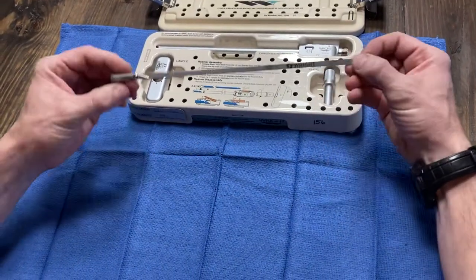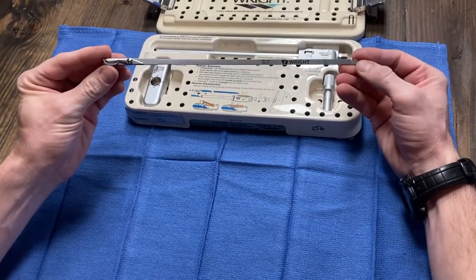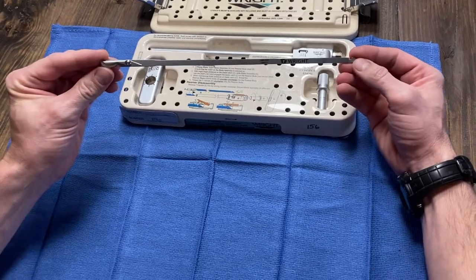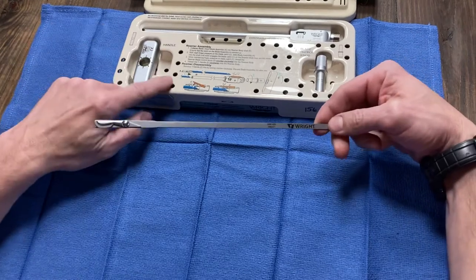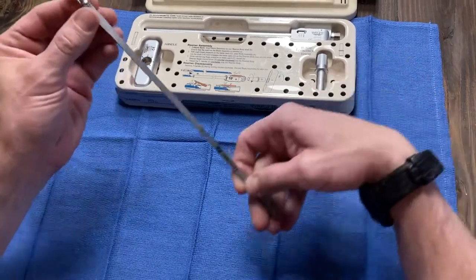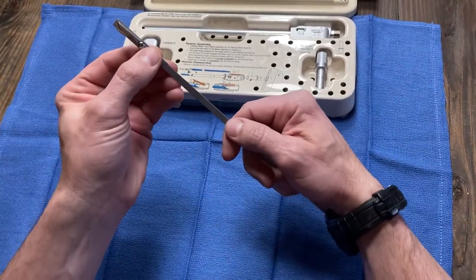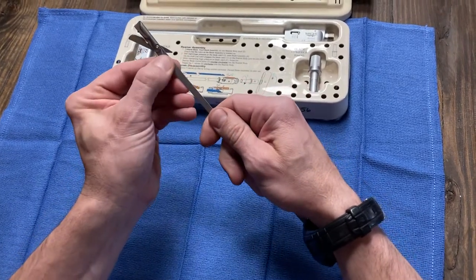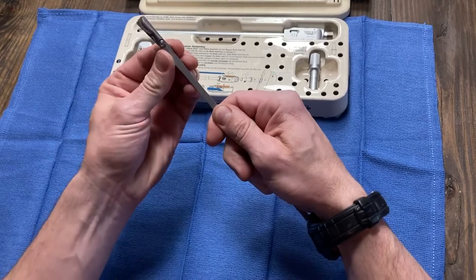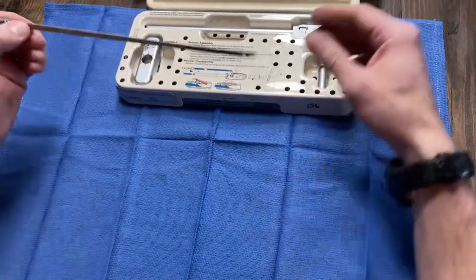This blade here is what comes sterile packed. This is the expandable reamer blade from Wright Medical. This goes inside the X-Ream T-Handle. These little blades here are sharp and they will cut you, and they're expanding like this — little windmill blades that come out. So those need to stay closed until you're using it.